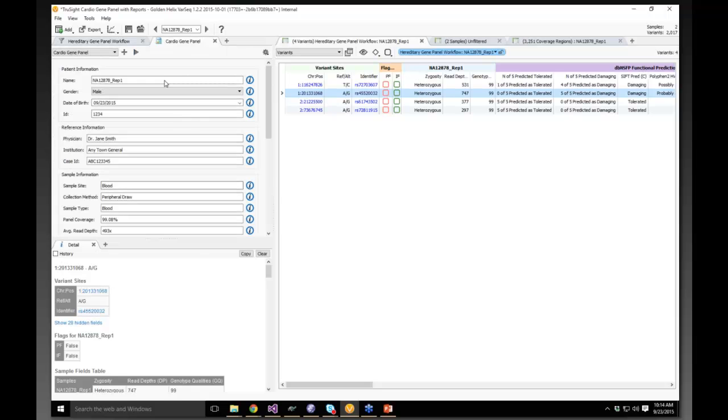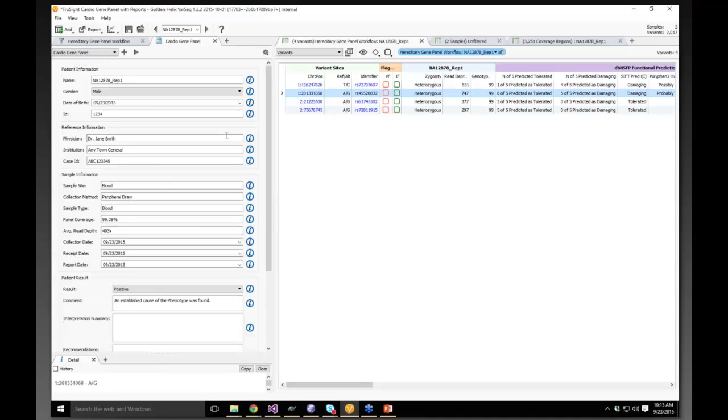And what this has is a report. We call these report templates selected here, and you can have a different template for different tests that you may have in your lab. It can be linked to your project and your workflow, so if you customize one for different tests, you can be running different tests throughout the day.